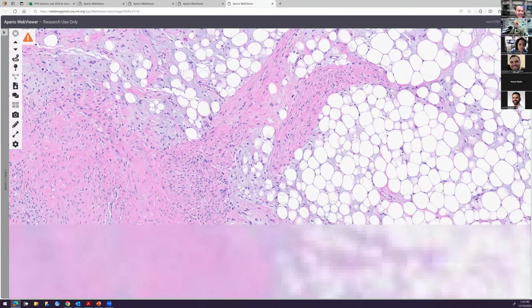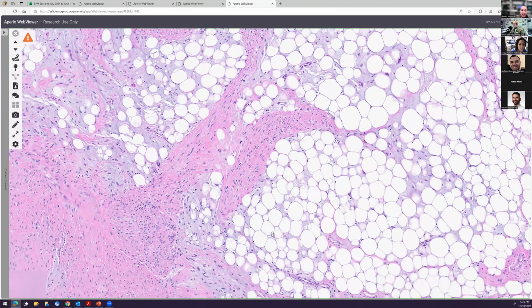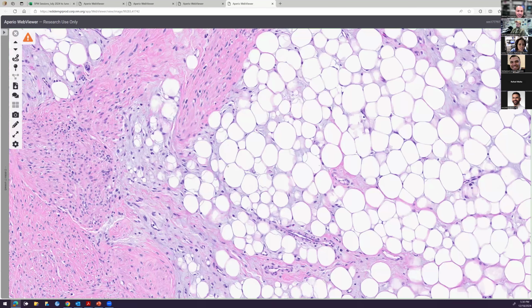Okay. So the challenging part for me is whether there is fibrous tissue as part of the lesion. In that case, I think the diagnosis would be something like fibrous hamartoma of infancy. But then another consideration is that this looks kind of chondroid, so I'm thinking a chondroid lipoma as well. All right, going for the weird stuff. Does fibrous hamartoma of infancy occur in the stomach or GI tract though? It'd be very rare, but I'm not going to say no. Never say never. Sure.